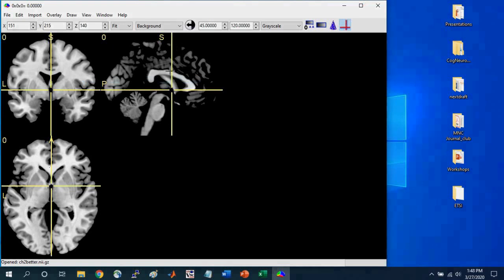And so wherever this crosshair is, that is where the brain is centered on a specific voxel. The voxel is a three-dimensional pixel.